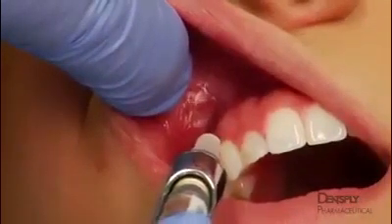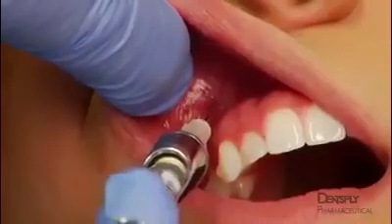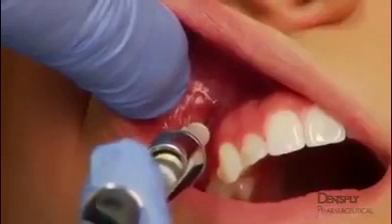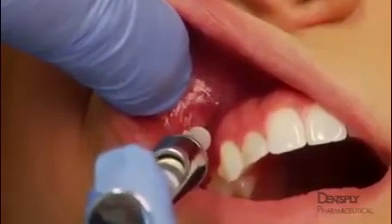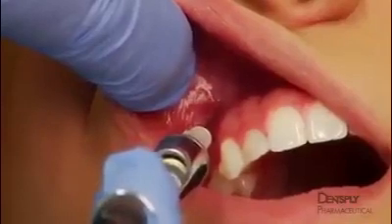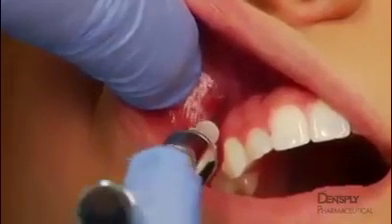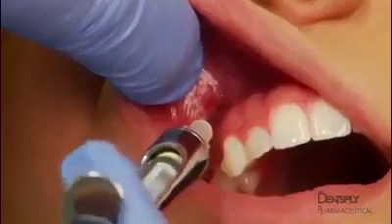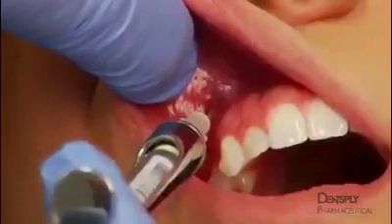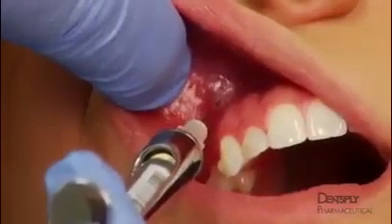Insert the needle at the height of the mucobuccal fold at the apex of the maxillary canine, just anterior to and parallel with the canine eminence, and at an approximately 10-degree angle off an imaginary line drawn to the long axis of the tooth. Aspirate in 2 planes prior to injection. Slowly deposit 0.6 to 0.9 milliliters of solution, about 1/3 to 1/2 of a cartridge, over 30 to 60 seconds.